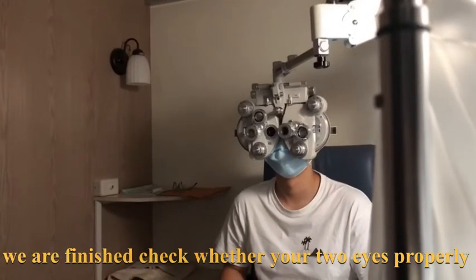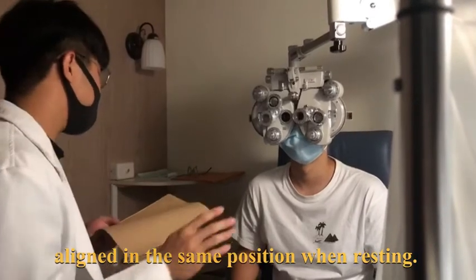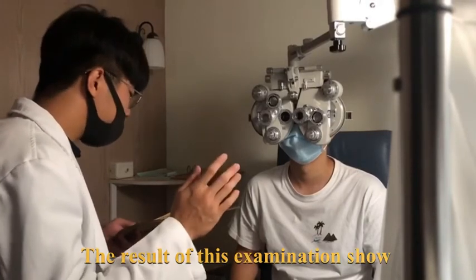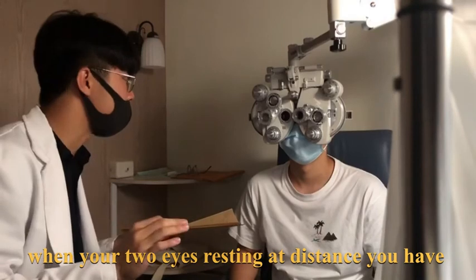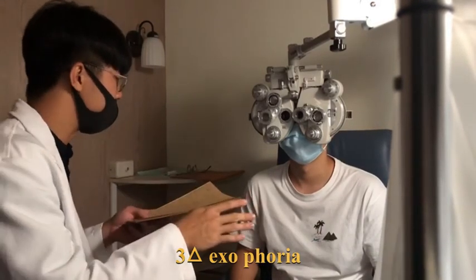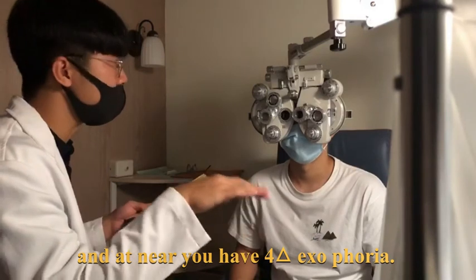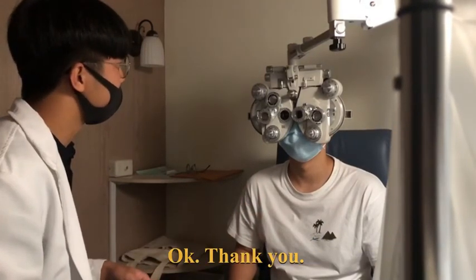We are finished checking whether your two eyes are aligned in the same position when resting. The results of the examination show that when your two eyes are resting at distance, you have 3 exophoria, and at near, you have 4 exophoria. Thank you.